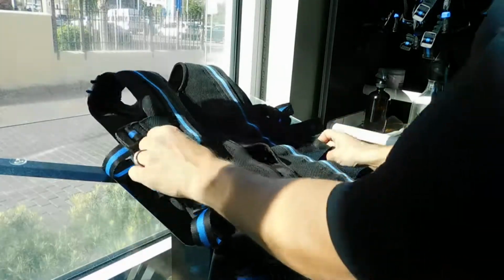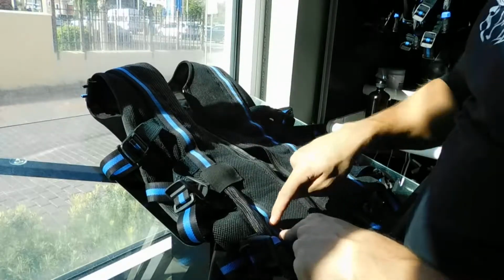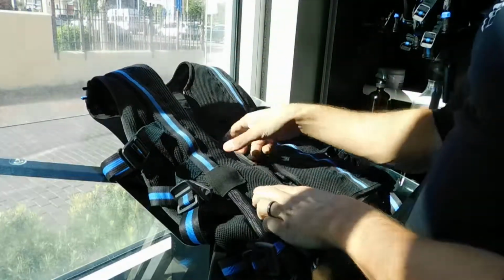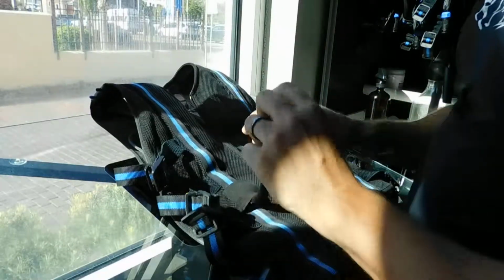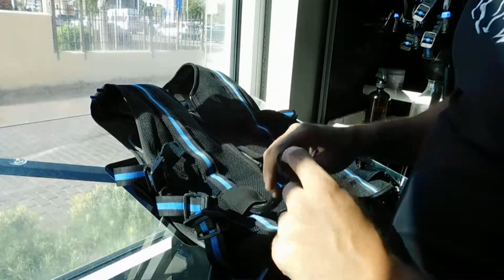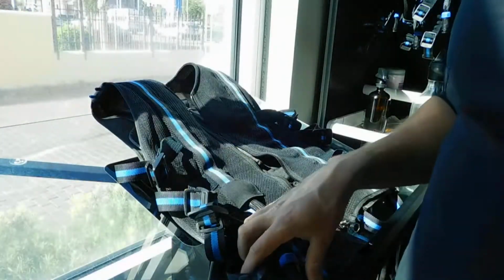And then, if it's still the problem, then it might be a cable somewhere inside the suit, because the cable runs behind this blue line, by the way, behind the Velcro, all over, everywhere. So it might be one of those cables. But then also it could be this itself right here, but usually it's not the case. But it could be the main cable on the machine.